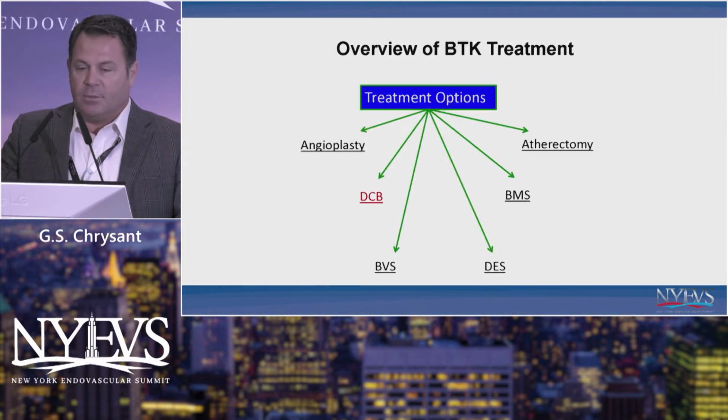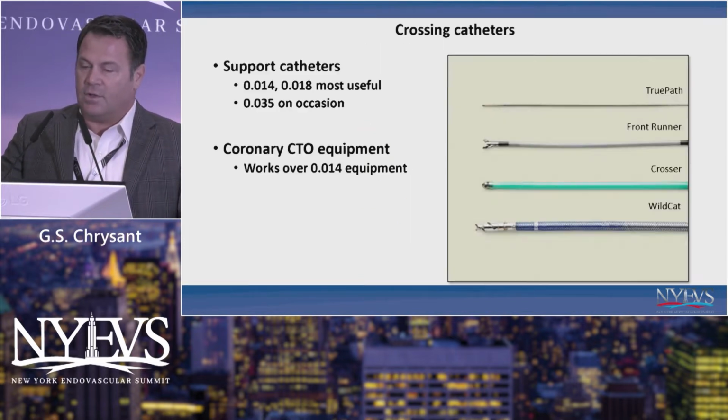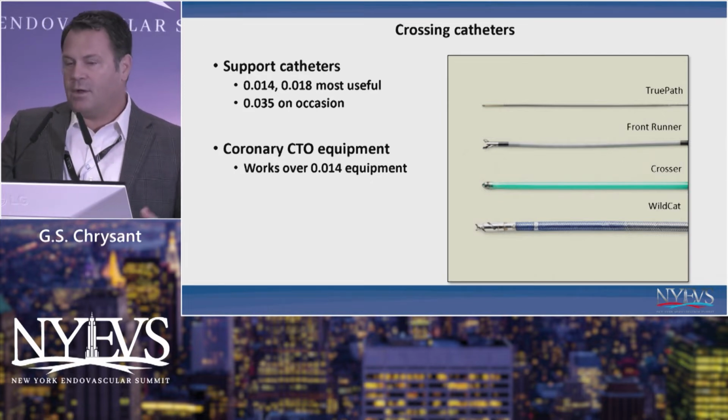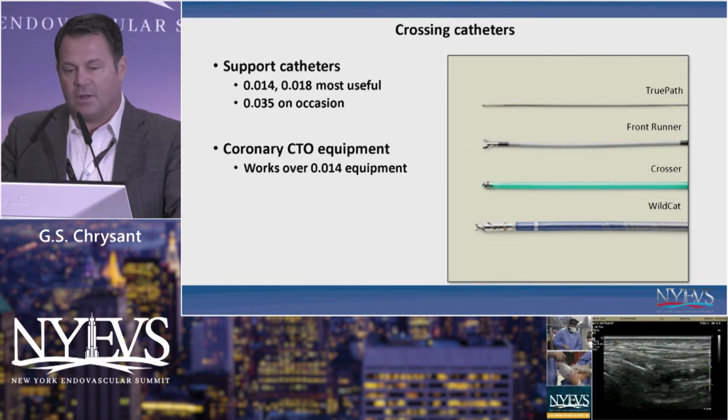So basically, you've got a variety of things. You've got angioplasty, DCB hasn't worked out, BVS may or may not work out. You've got coronary DES that works. You have bare metal stents that haven't been too promising, and you've got atherectomy, as well as an assortment of wires and support catheters. This isn't an exhaustive list, but support catheters 014, 018 are most useful to me. Every once in a while you can pop across a larger vessel with an 035 system, but most of us are using a lot of coronary CTO equipment and 018 equipment because the wires have simply gotten so much better.